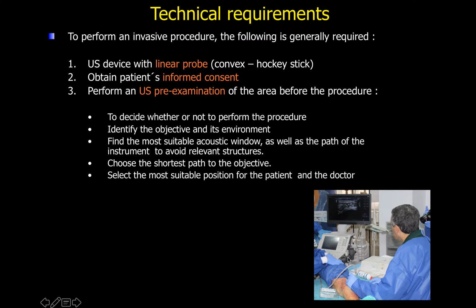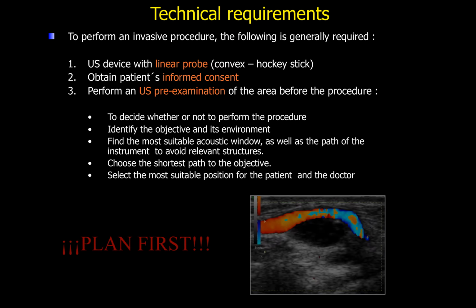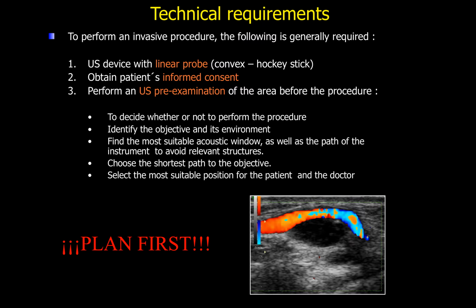This is very important because we have to maintain in a line the monitor, the injection, and the view of the operator, just to have all in a line like a hunter does when he goes to hunt. This is real planification. We have to plan first and then act and make our injection.